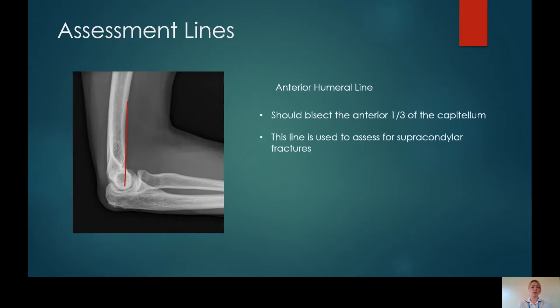The first assessment line that we'll discuss is the anterior humeral line. This runs down the anterior aspect of the distal humeral diaphysis and should bisect the anterior third of the capitellum. We use this line to assess for supracondylar fractures, which although are far more prevalent within the paediatric population, we do also see them within the adult population. If more than or less than a third of the capitellum is bisected, you'll be looking at a displaced supracondylar fracture.